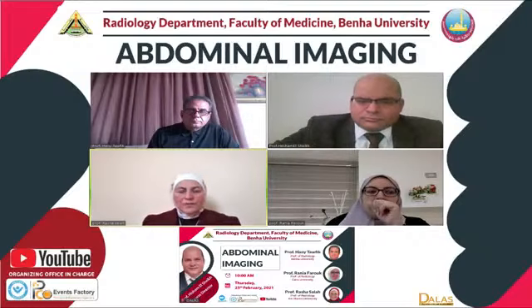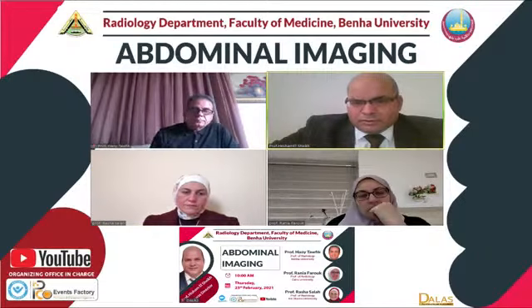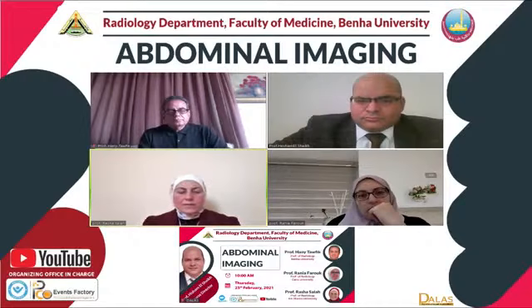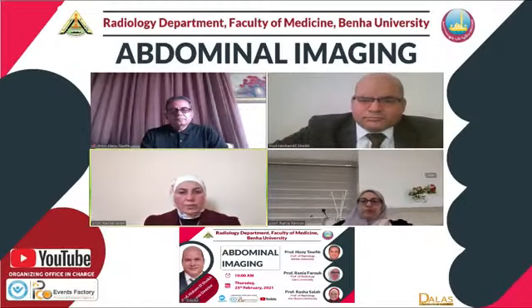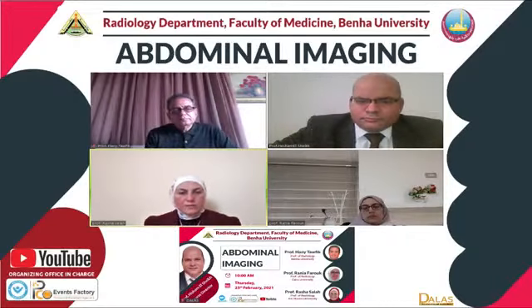فلو انا عايزه اعمل وان ستوب شوب واعمل وان اكزام واجيب بيها كل الداتا، اي جاس ان الام ار بيت كومبوننت هو ده اللي هيبقى ذا بيست available تول يعني. even initial assessment، في كل حاجه، الانيشال والبوست تريتمنت وبعد لو في سسبيشس للريكورنس، لان ساعات بعد الجرانيوليشنز بعد السيرجري لو كنا والتايمنج بتاعنا مش مظبوط، فالكومبينيشن بتاعه البيت بتبقى فيه uptake في الجرانيوليشنز ديت، فلو احنا التايمنج مش مظبوطه قوي في الاسسمنت فممكن يبقى عندي فولس بوزيتيف ريزلتس يطلع لي في البيت كومبوننت. لكن لما بحط الام ار اي بكل التولز بتاعته مع البيت كومبوننت، الكومبينيشن دول مع بعض، يعني انا جبت اعلى 2 ايميجنج موداليتيز available، فبتبقى الاكيورسي بتاعتها هتبقى اعلى كتير من ان انا اعتمد على 1 ايميجنج موداليتي لوحدها.